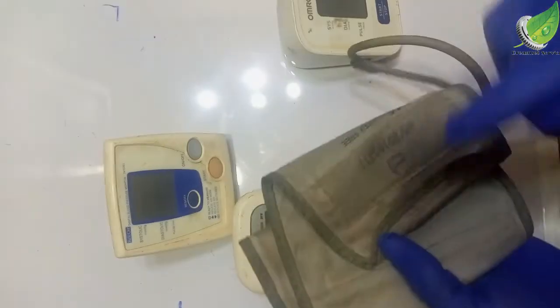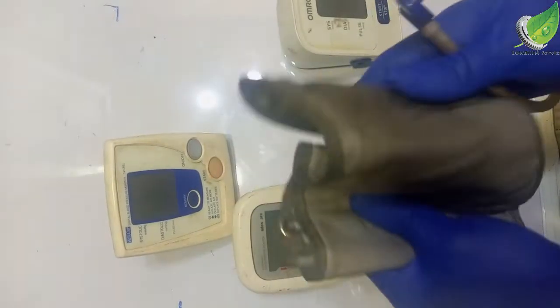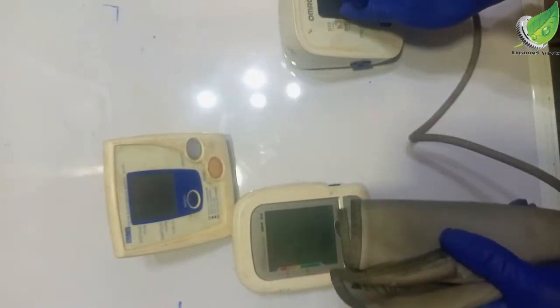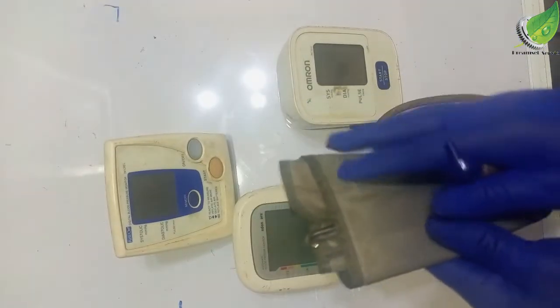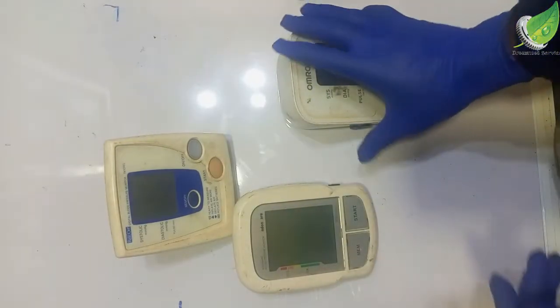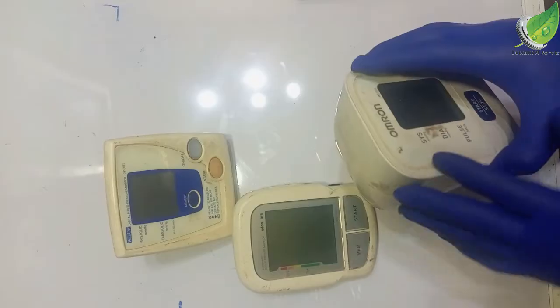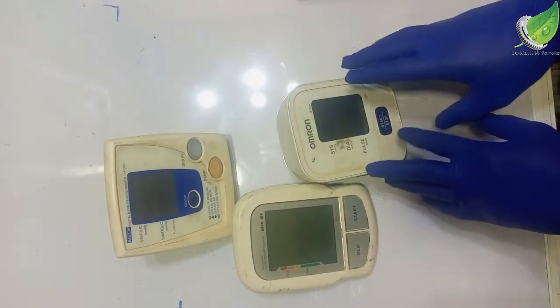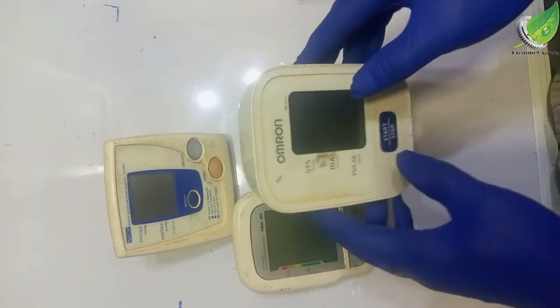Probably there is a leakage somewhere in the cuff that is making it impossible for it to hold enough pressure to be able to give you a reading on the machine. So you might want to replace your cuff, try out with another cuff. If after doing all of these things the problem persists, I'm going to open this up and show you how to fix the problem from inside the machine, because at this point the problem is likely from the machine.